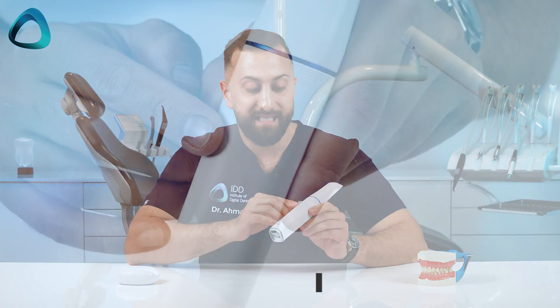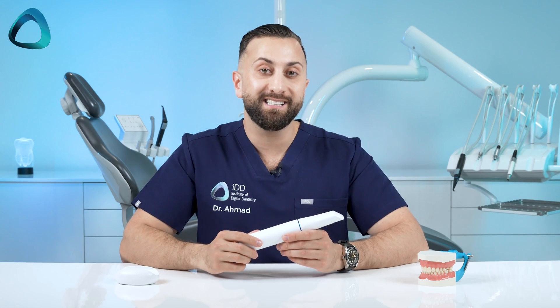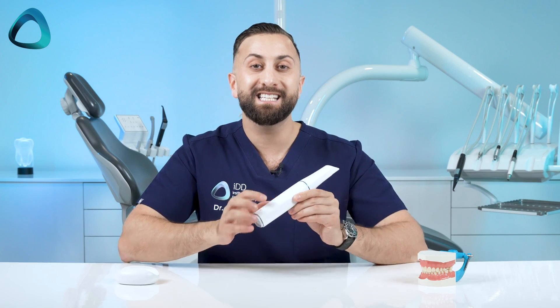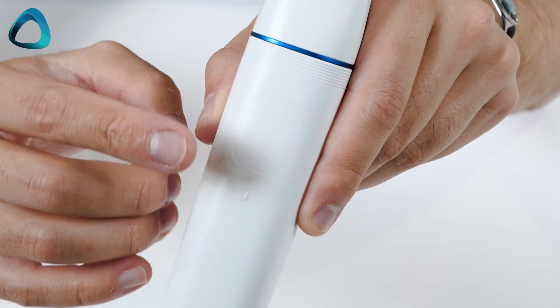Underneath the touch band is the touch pad, used to inspect any scan data without having to touch the computer. You can zoom, pan, and rotate your scan data easily using this touch pad. The third touch interface is the menu button, which allows you to move through the scanning workflow and align scan data to the center of the screen. Using these three touch interfaces, you can control the entire scan process without ever having to touch the laptop.